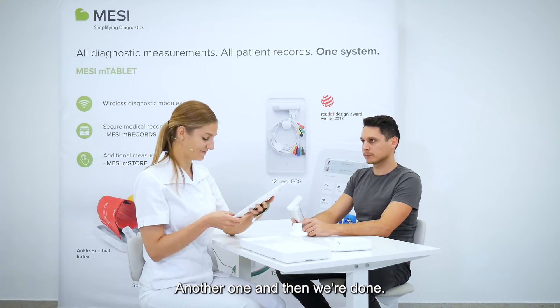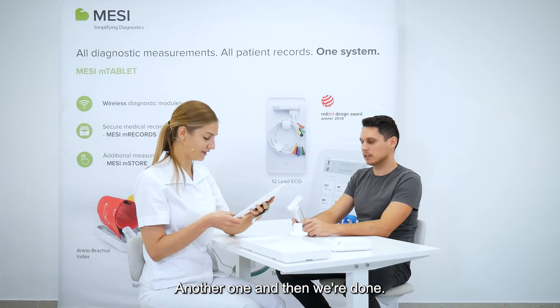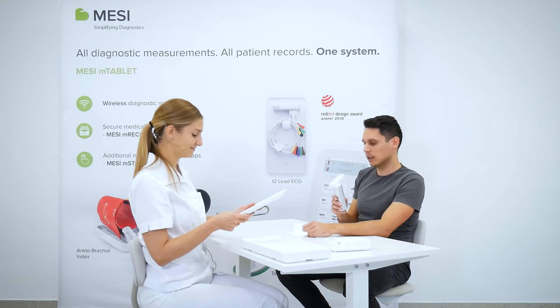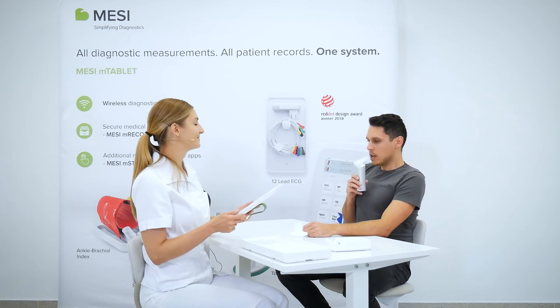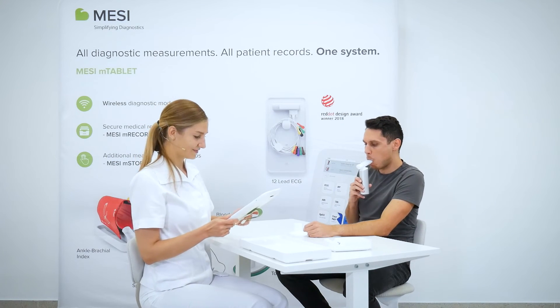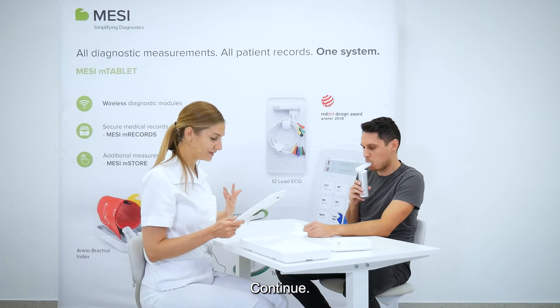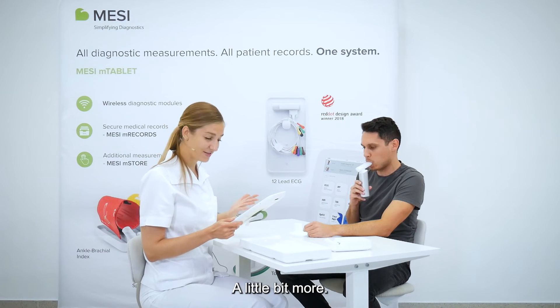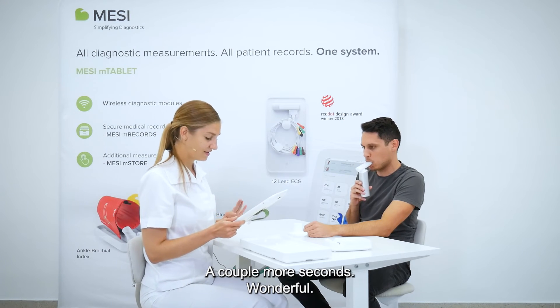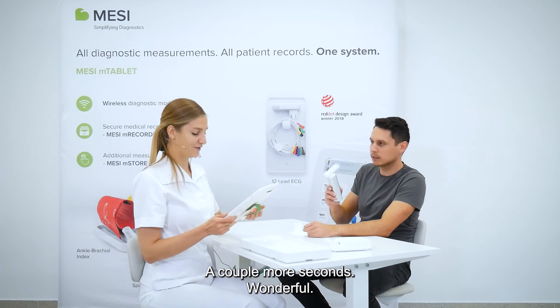Another one, and then we will be done. Continue, a little bit more — a couple more seconds. Wonderful.